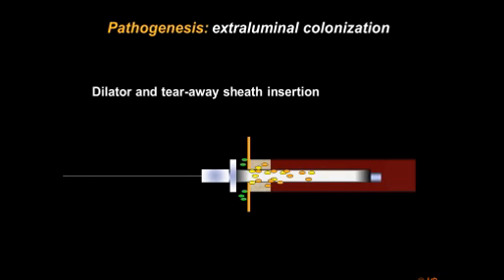We then remove the guide wire. We then remove the dilator. And then I want you to think for one moment: to this point, how many times have you touched the skin in this process? I would say quite a few. And that's a part of the procedure. But just know how important that preoperative skin prep was, because now your gloves are contaminated.